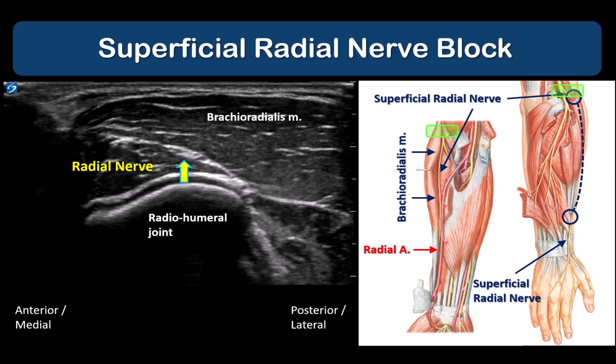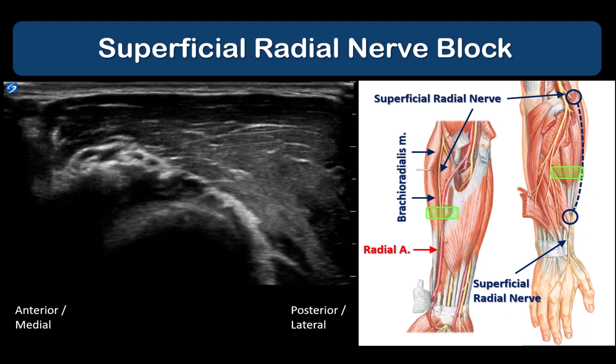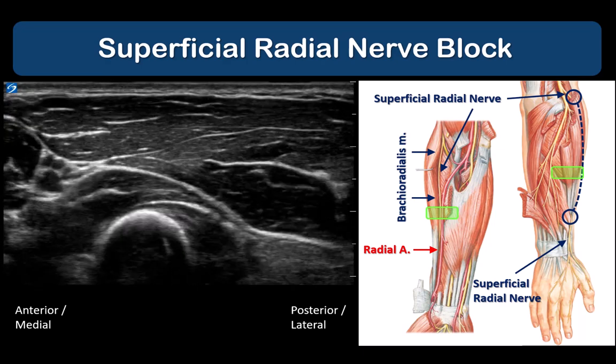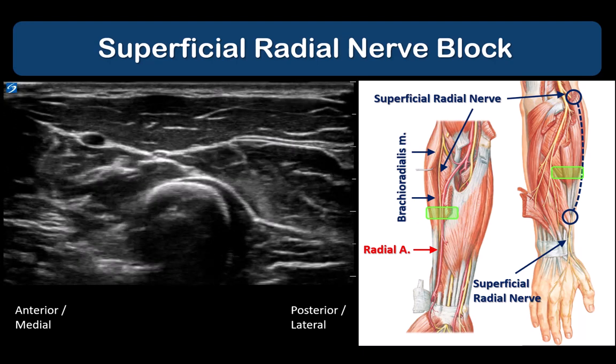With the forearm in the supinated or mid-pronated position, the probe is placed over the lateral surface of the forearm. At the elbow joint, the radial nerve is an elongated structure under the brachioradialis muscle. As the probe is slid distally, the radial nerve continues under the muscle and splits into superficial and deep branches, the deep branch traveling off in the posterolateral direction.